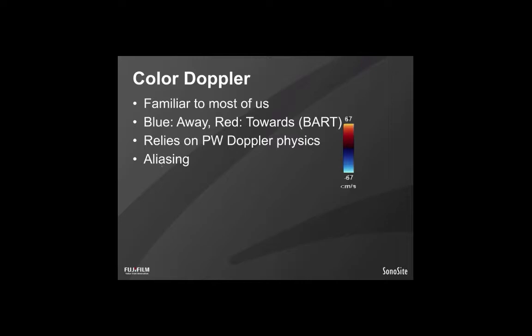And that is, of course, because when you're using pulse wave Doppler or color, you can think about the fact that the ultrasound machine is sending a Doppler signal to that particular area and must wait for the return signal. So it's a send and receive cycle that is at the heart of color and pulse wave Doppler. And whenever you have a cycle like that, a resolution cycle, that cycle eventually can be maxed out.